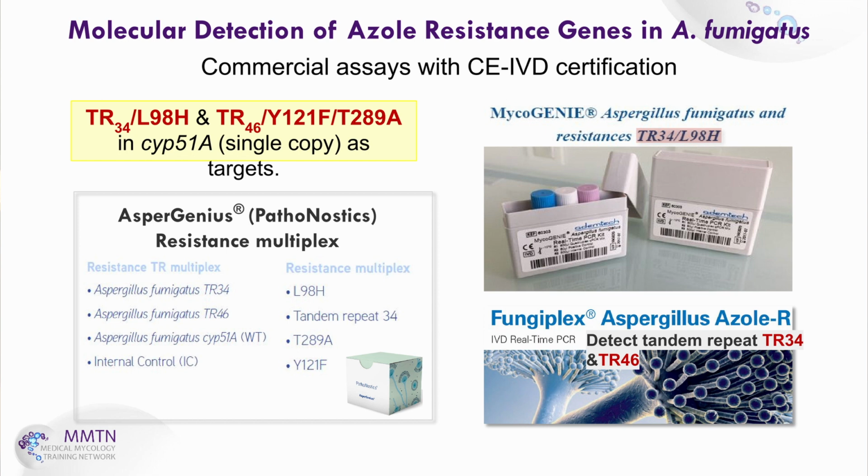They all have a CE-IVD certification, and they detect the environmental resistance genes, that is, TR34 and TR46 related resistance. So we cannot detect resistance due to patient-acquired resistance.